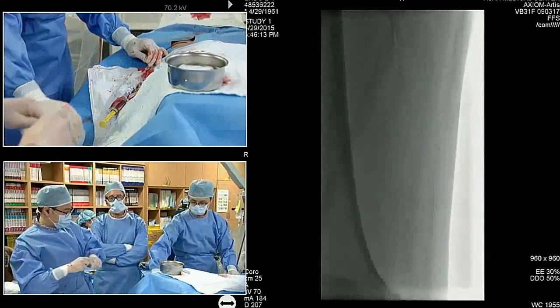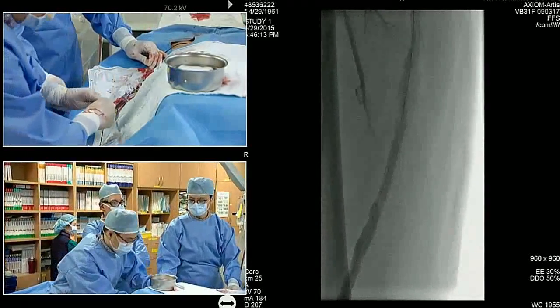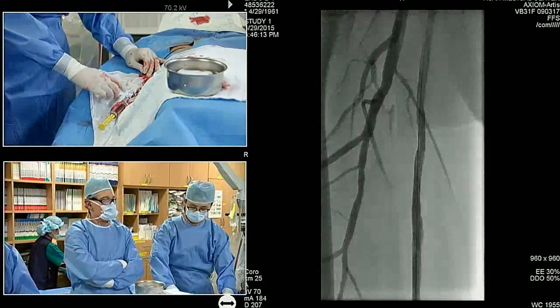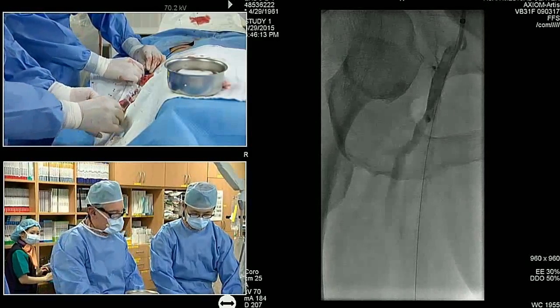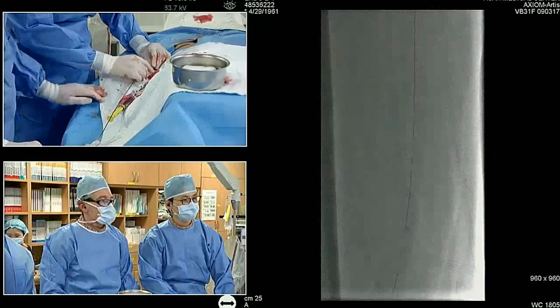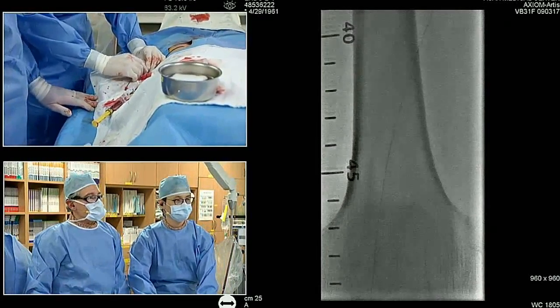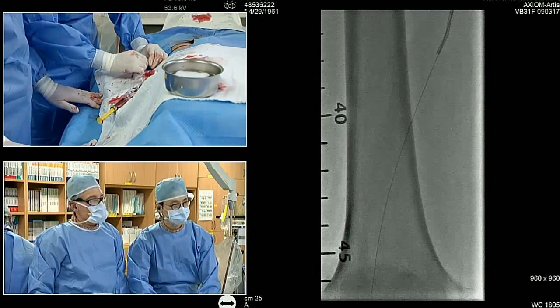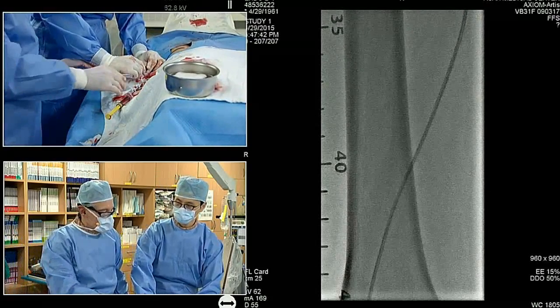So I would think he's so symptomatic and has such a low ABI because it's a recent thrombosis and he has not developed robust collaterals, would be my guess. Profunda is wide open, but as you can see, there's not that many communications between the profunda and the SFA. There's one distally, but it's not very robust. This collateral had a stenosis as well, right? That one that went back to the SFA. I didn't think so initially. It might be some balloon-induced spasm or something.